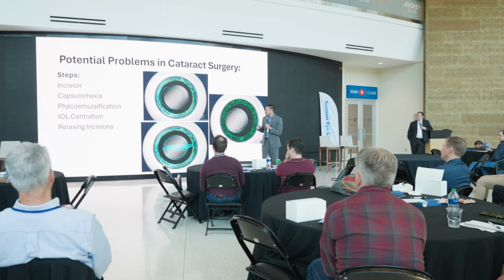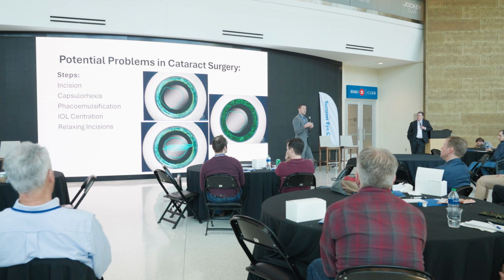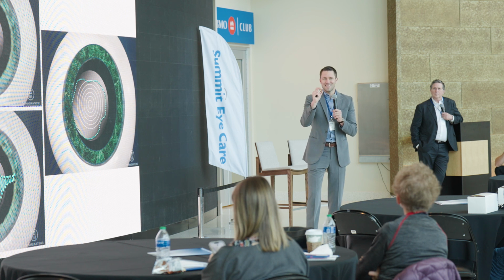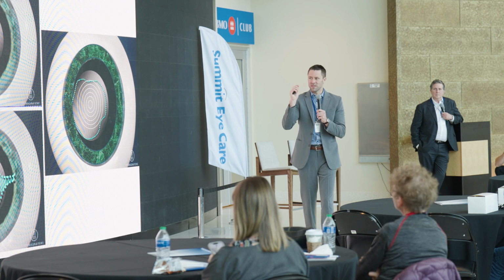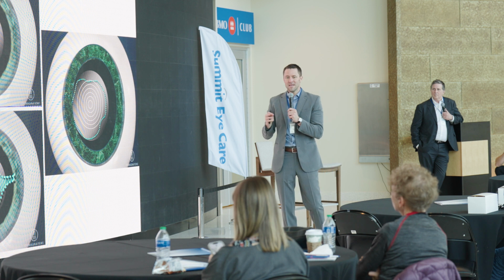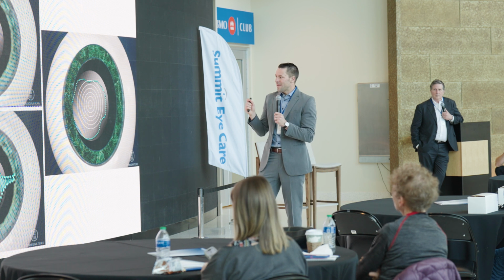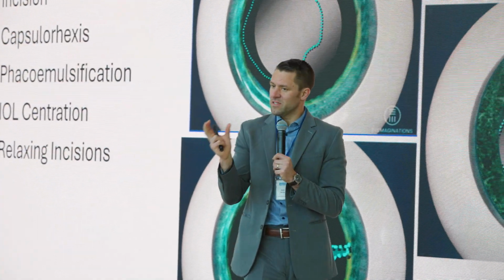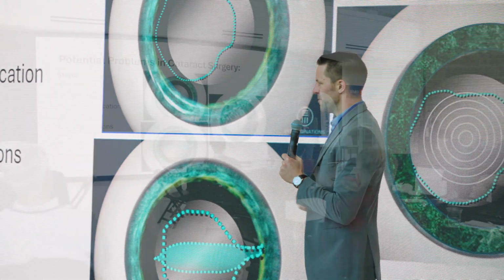The fourth thing is centration. Now, as I said before, all of our cataract surgeries are now refractive cataract surgeries, right? All of our patients have some level of expectation. They want to be able to see as well as possible. If our lens is not perfectly on center with the axis of the optical system, you're going to have a subpar outcome. Now, not to mention with a multifocal or some sort of premium lens, if it's even more off-center, you're going to have a worse outcome.